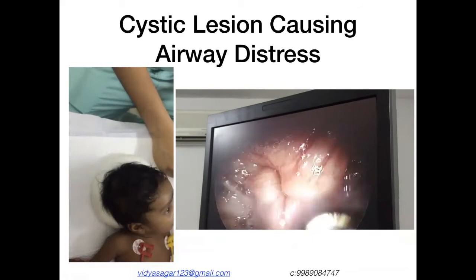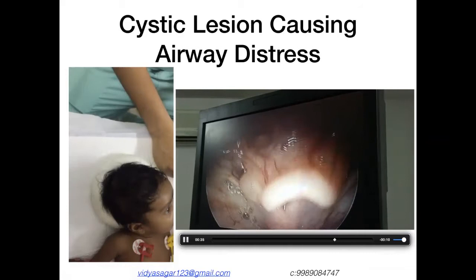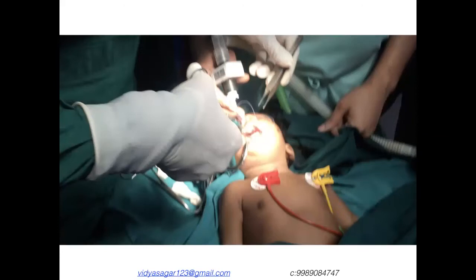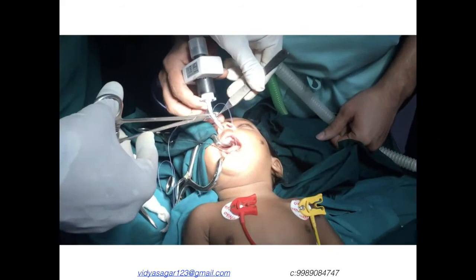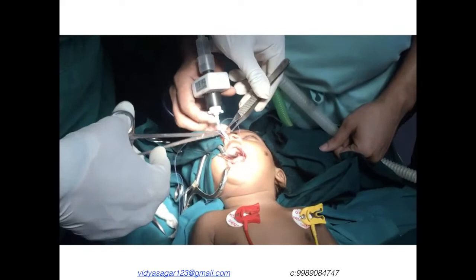To approach this, we placed a tongue stitch — the repose suture technique — as we couldn't insert even a regular tonsil mouth gag. Using the Jennings mouth gag, we passed the stitch through the tongue base and pulled it out to retract the tongue base.